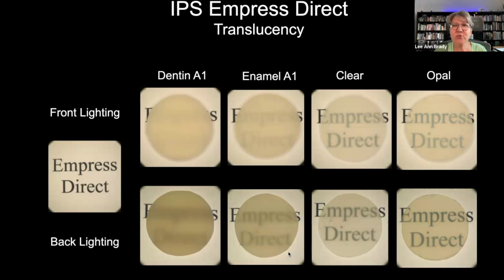And so I'm going to show you two of these graphics. This first one is a beautiful anterior composite from Ivoclar that's called Empress Direct. It's actually one of my favorite composites to use in the anterior. And this graphic is one that a lot of you probably have never seen, but every sales rep for every dental manufacturer has this graphic relative to their composites in a PowerPoint that they got from corporate marketing someplace. And this honestly is the most important piece of information that you need about whatever composite you use to do anterior restorations. Doesn't matter in the posterior.